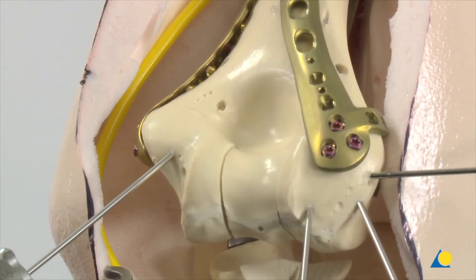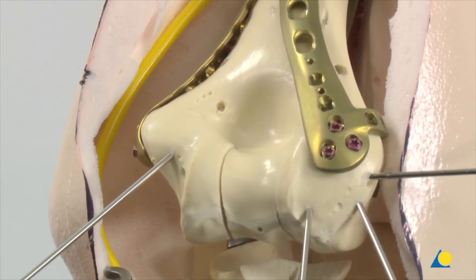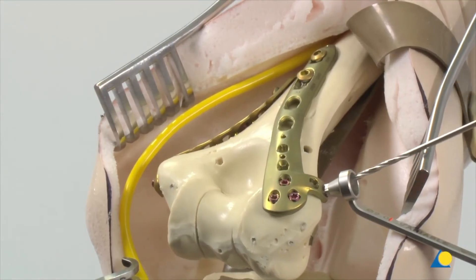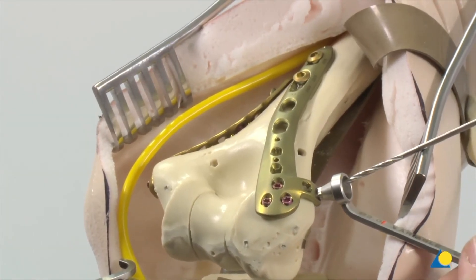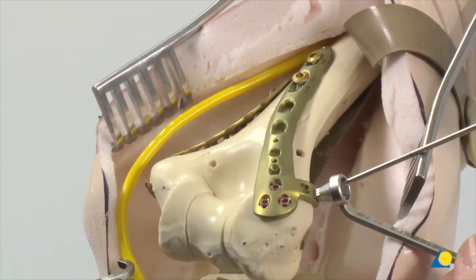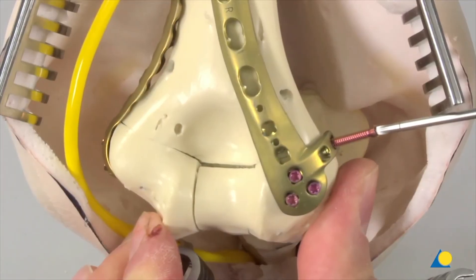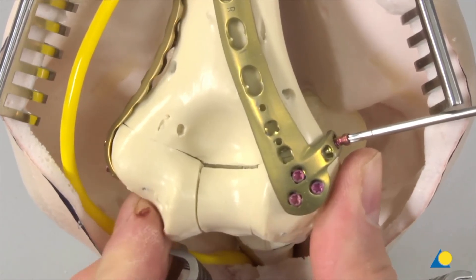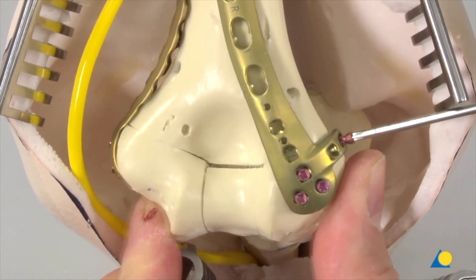All the K-wires are now removed. Use the funnel-shaped end of the VA-LCP drill sleeve to insert variable angle locking screws through the plate holes in the lateral support. The screws of the lateral support target the articular block.